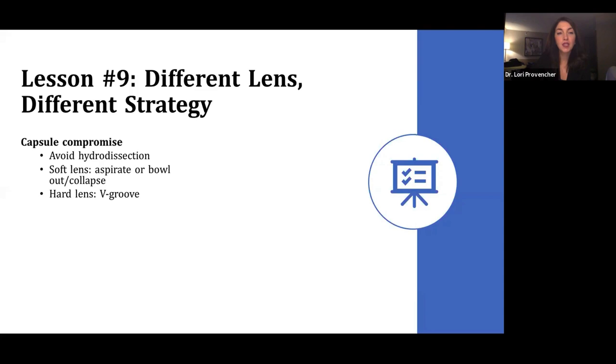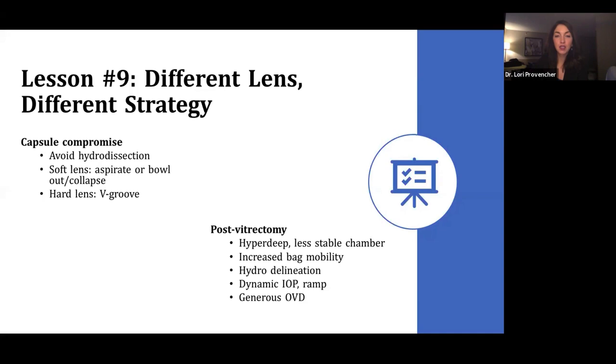For eyes that have been vitrectomized, you need to anticipate that the chamber could be hyper-deep. You don't have that vitreous there to stabilize the eye like you once did. The chamber is going to be less stable. The bag is probably going to be more mobile. So in these eyes, I like to do hydro delineation, because then you have a nice cortical, epinuclear shell there to keep the bag back and stable. You want to be ready to adjust your IOP. So when you're doing cortical removal, you might want a little higher IOP to keep the bag back. During these cases, I would advise you to be generous with your viscoelastic.